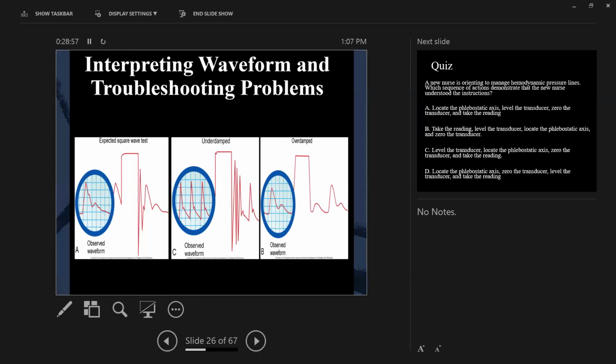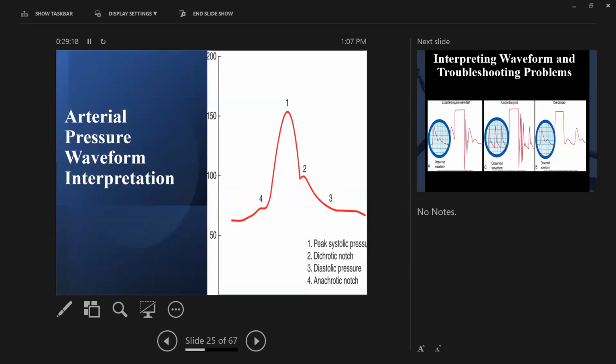Lorraine. Mm-hmm. If you have an irregular heartbeat, does that mess with it? No, what'll happen is if you look at the monitor, with every contraction, you should see an arterial waveform. They should match up. You have your QRS waveform, and right below it should be this waveform. If I'm irregular, you're just going to see those irregular. It's going to come early, so it's not going to look regular, just like your irregular heartbeat.